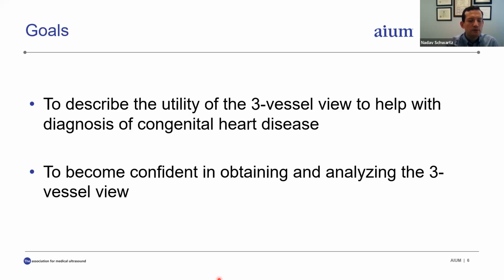And we're taking this approach because really often in the reading room in the ultrasound unit, it's a collaborative approach. Not every single situation will you be able to know exactly what's going on, and everybody brings their own perspective, from the sonographer to the trainees and junior docs, and then the old folks like me. So our hope is that we each will bring our own perspective to help you understand the 3-vessel view and hopefully incorporate it into your practice.